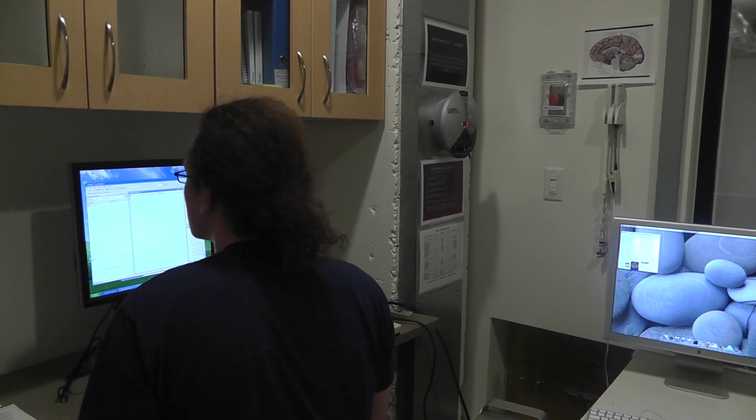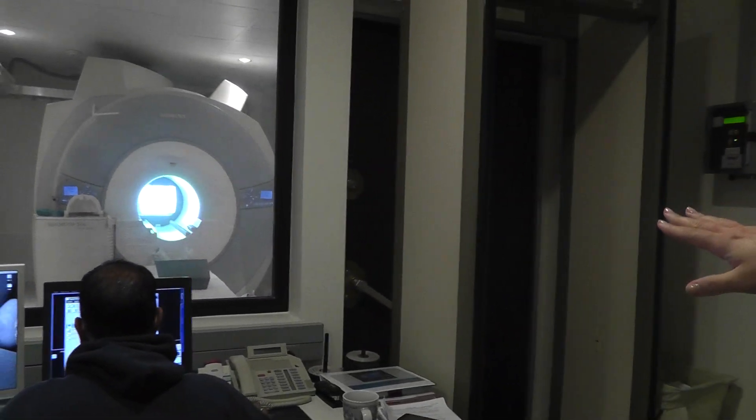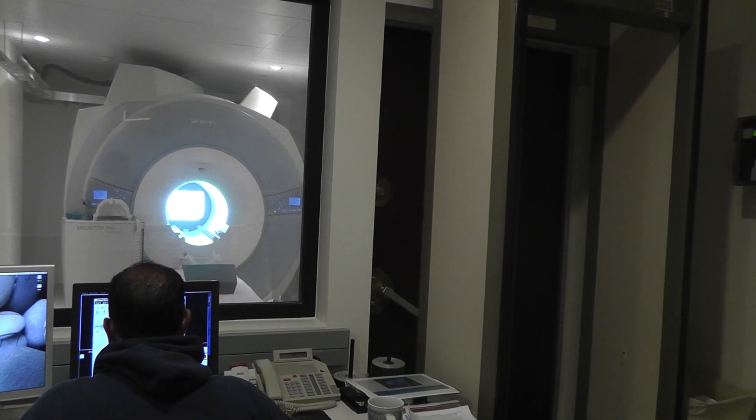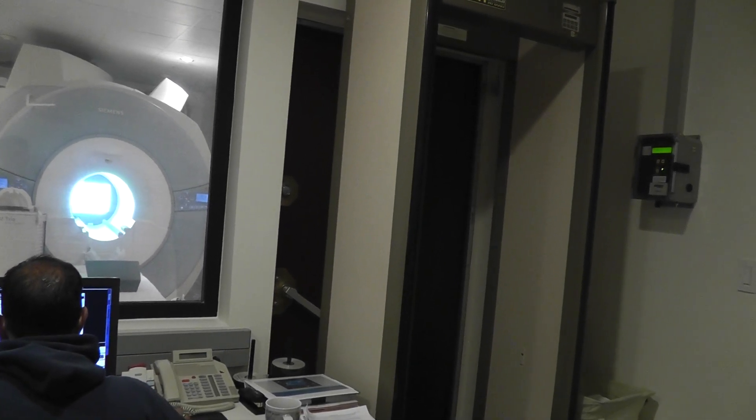I'll come out there in a second to let you in. So Lydell, here's what's going to happen. You're going to lay down and you're going to have headphones over your ears. That'll protect you from the sound of the scanner.